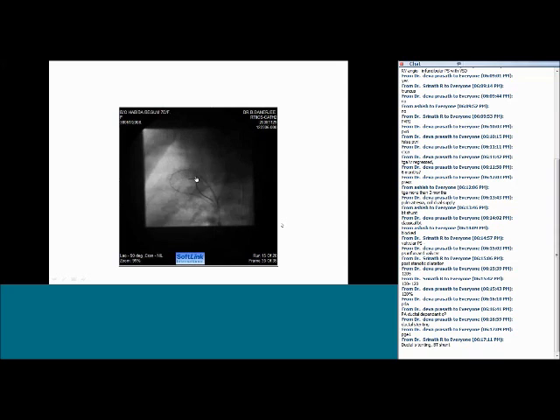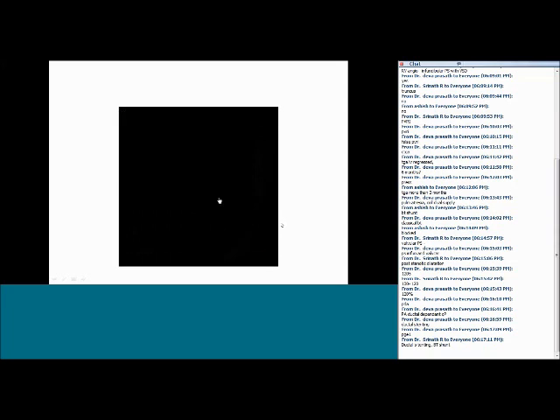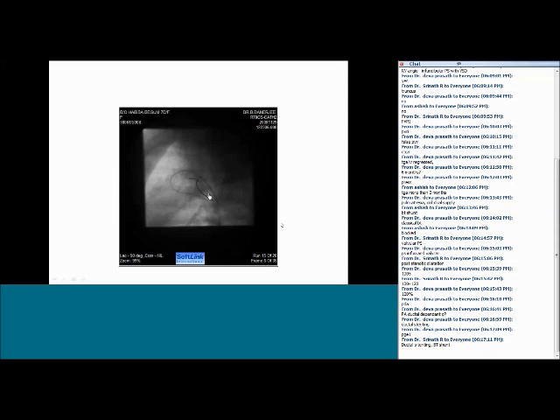What is the basic philosophy of ductal stenting? The principle is that you should cover both the ends of the ductus when you are doing a ductal stenting, because the ductus tissue is a very contractile tissue and spasmodic tissue. It can anytime go for spasm. So you have to cover both the pulmonary end and the aortic end of the ductus properly, otherwise it goes into spasm. If you see, this is the first stent here, and the second stent starts from the end of the first stent and comes deep into the descending aorta.